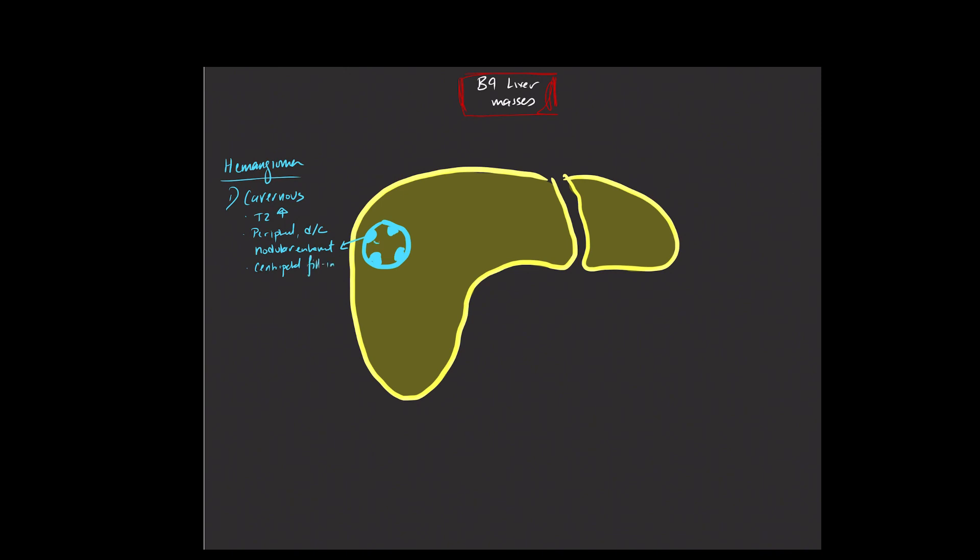As you enhance from the arterial to the portal venous to the equilibrium and other phases, the amount of enhancement within it will follow the degree of enhancement within the blood pool at the time of imaging.